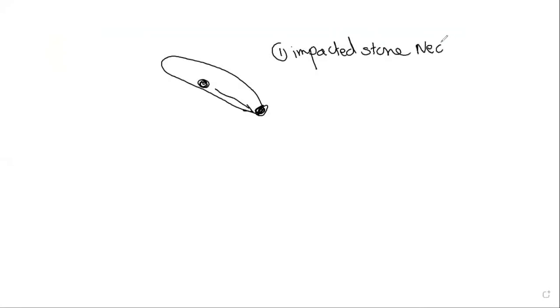Okay, we say this in Arabic. All right, so the impacted stone at the neck would make the gallbladder distend as such. It is obstructed, thus it would be distended with bile. And this would lead to the second point, distension of the gallbladder.